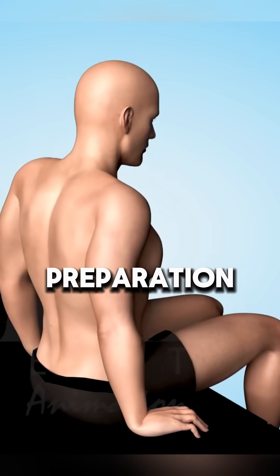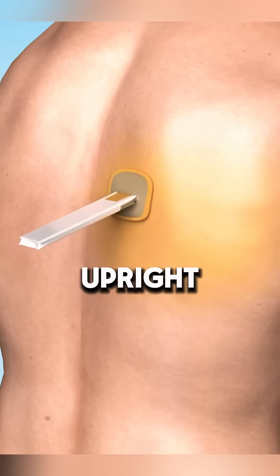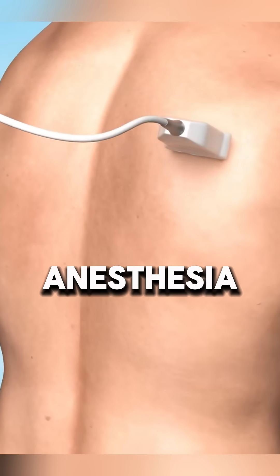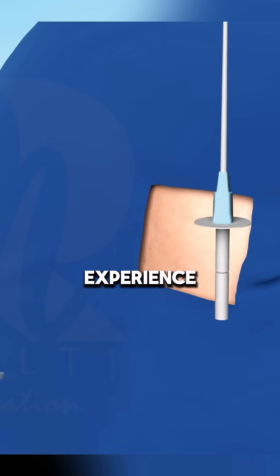Here's how it works. Preparation: the doctor explains the procedure, answers any questions, and positions you upright and slightly forward for comfort. Sterilization and anesthesia: the area is cleaned with a sterile solution and a local anesthetic is applied to numb the site, ensuring a pain-free experience.